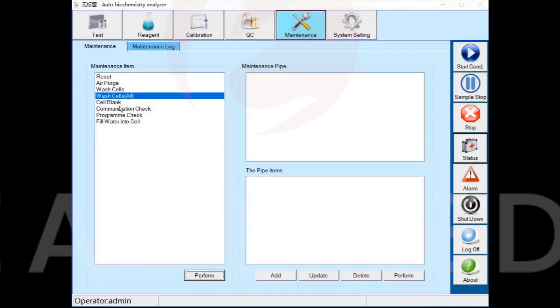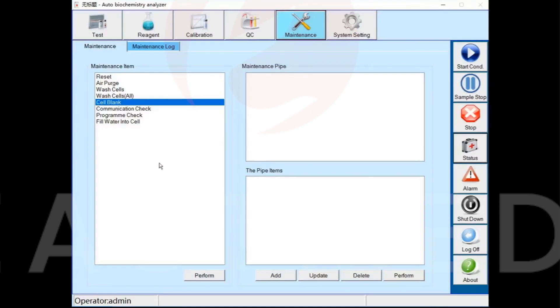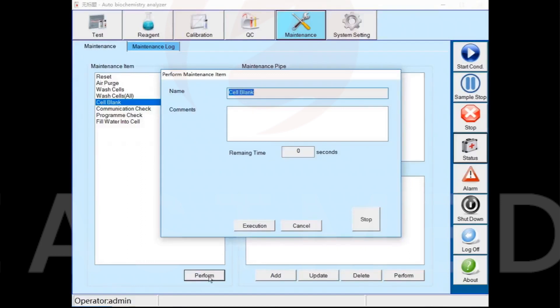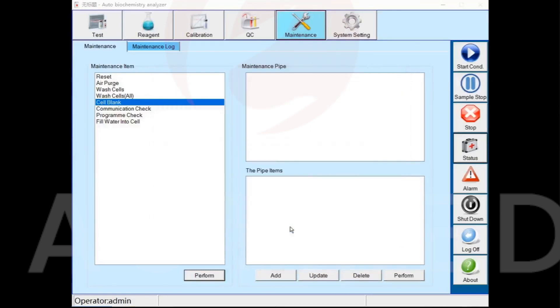Fill blank function: the instrument will perform blank and absorbance tests for all cuvettes. For example, if the measured absorbance value is less than 20,000 or more than 62,000, the instrument will alarm.